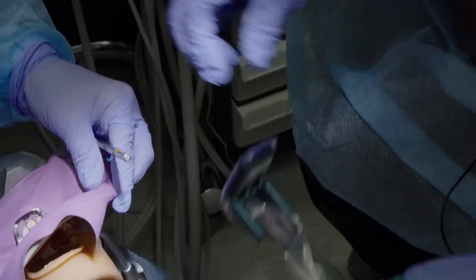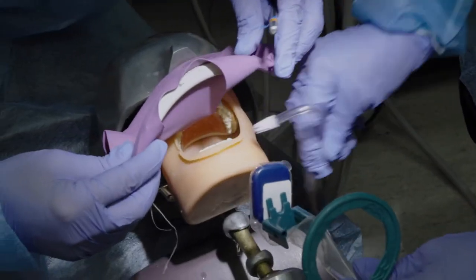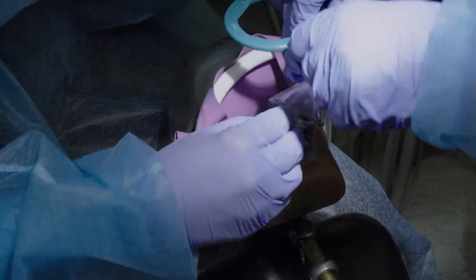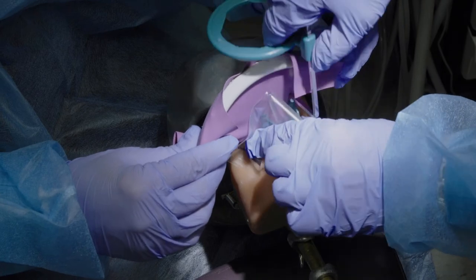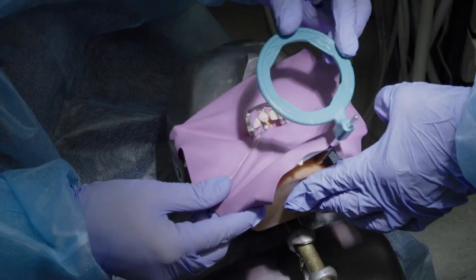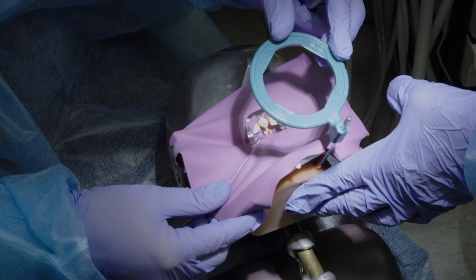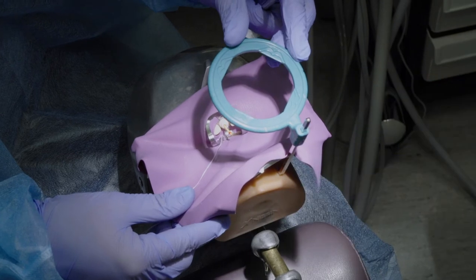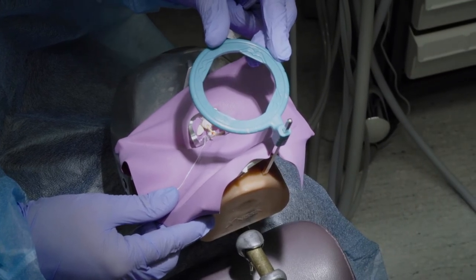And the assistant will now help the dentist with the taking of the endodontic image. This is to determine the working length, just to verify it. We would place at this point a lead apron also along with the endodontic image.